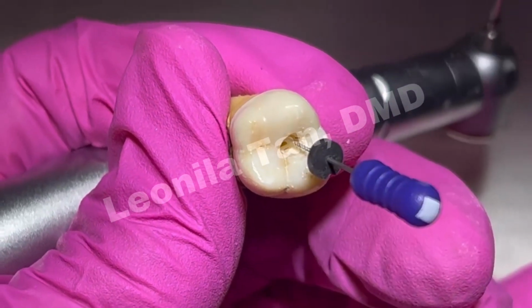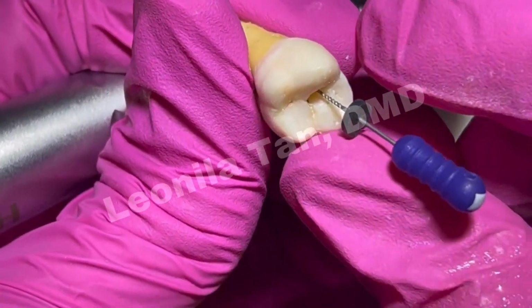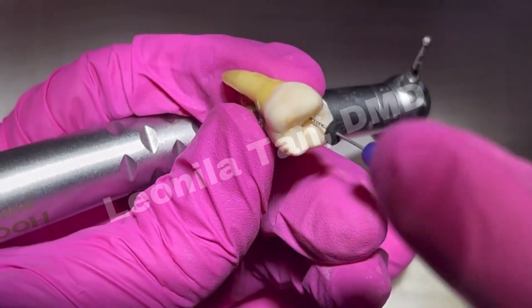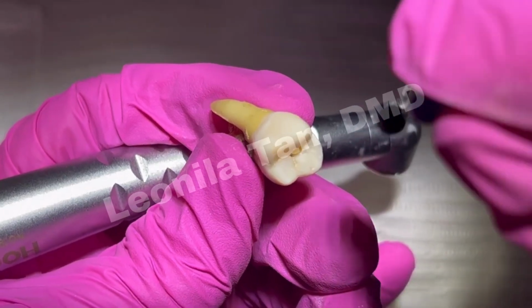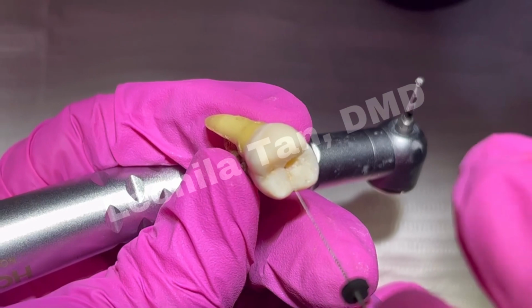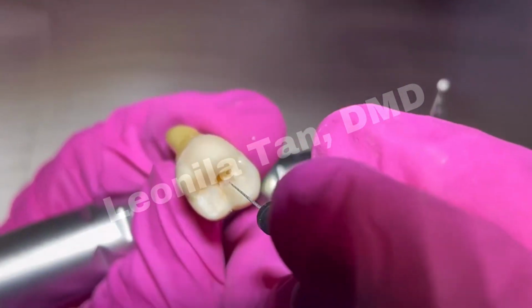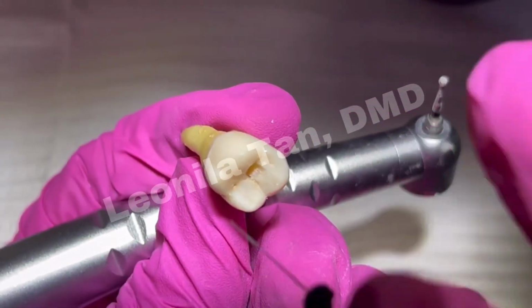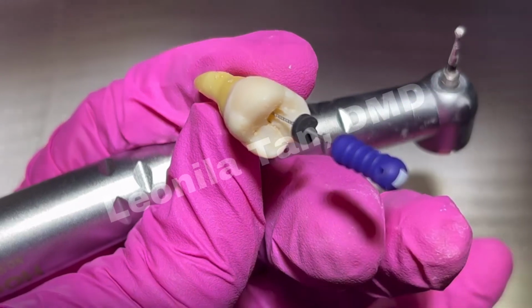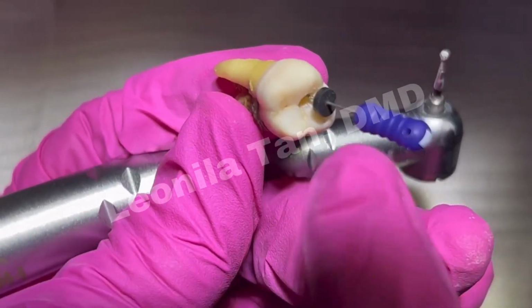Notice the first canal that you should locate for maxillary molars is the palatal. If by chance your file goes into the mesial, that means your entry is wrong, and that will affect your outline form and entry to your canal. So always, the first canal to locate in your maxillary molars, from first to third molars, is the palatal.